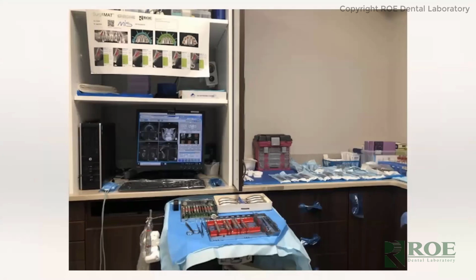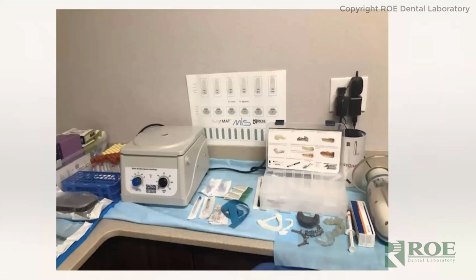This is our surgical suite that's set up beforehand. We have the computer screen behind us. This is where I used to hang the notes for what I was doing. Now I just put this behind me. We have the patient sitting in front of that, 12 o'clock there in our surgical suite. We have another computer on the other side of the patient that we can use also. To the side, we have, obviously, our instrumentation, the PRP machine, but also you can see our robots is always set up and out.